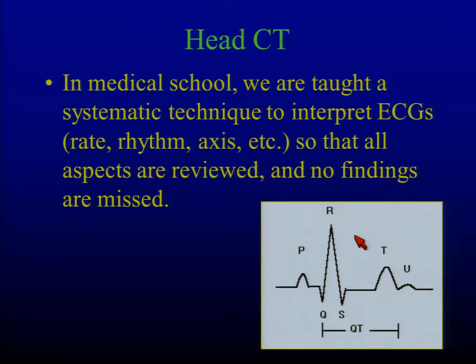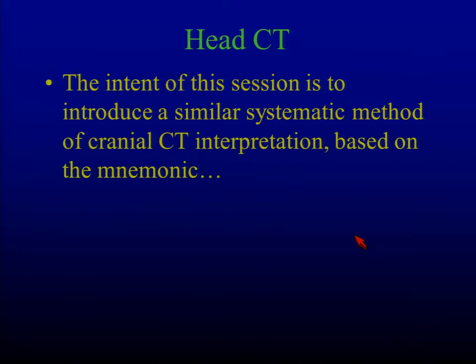So in medical school, I learned how to read an EKG by doing Dubin, the little orange book, where you do rate, rhythm, axis, P, Q, R, S, T, and intervals. And what I tried to do is I was teaching my fellow residents as my resident project, how do you read a head CT? How do you break down pattern recognition into a thing that you can do over and over? And it was kind of the same thing.